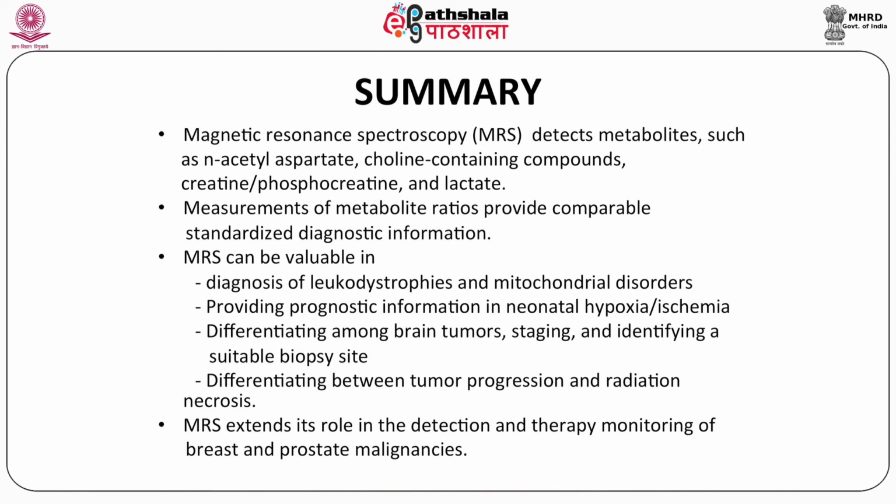MRS can be valuable in diagnosis of leukodystrophies and mitochondrial disorders, providing prognostic information in neonatal hypoxia, ischemia, differentiating among brain tumors, staging tumors and identifying suitable biopsy sites in tumors, differentiating between tumor progression and radiation necrosis.